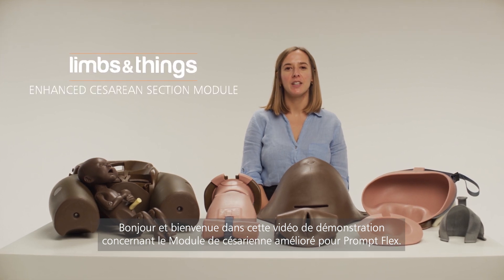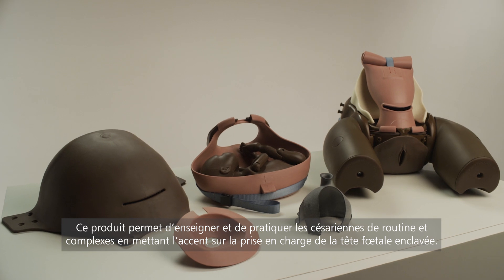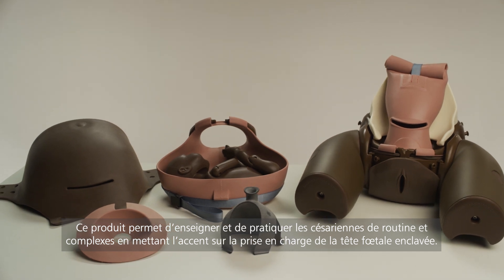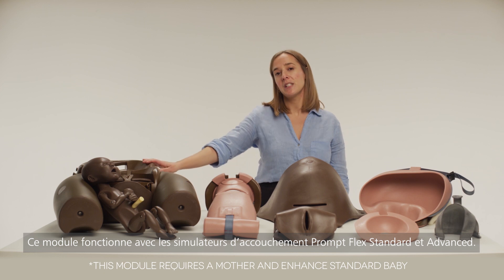Hello and welcome to this demonstration video for the Enhanced Caesarean Section Module for PromFlex. This product enables the teaching and practice of both routine and complex caesarean sections, with particular focus on managing an impacted fetal head. The module works with the Birthing Simulator PromFlex, both standard and advanced.